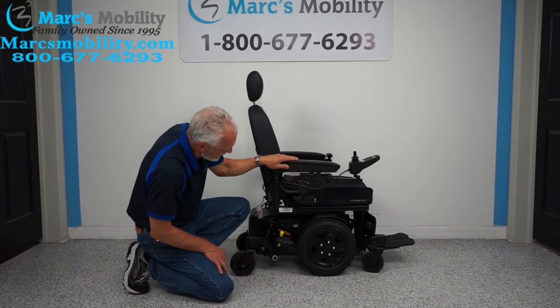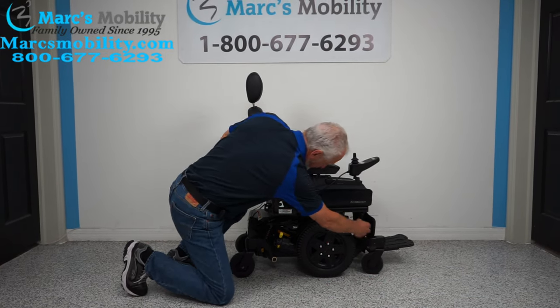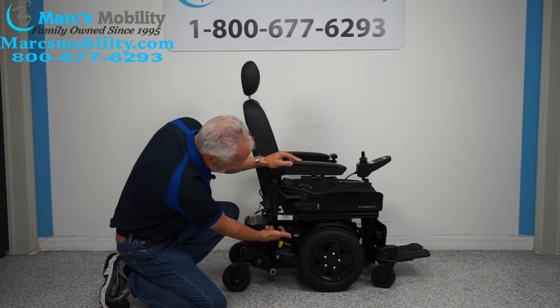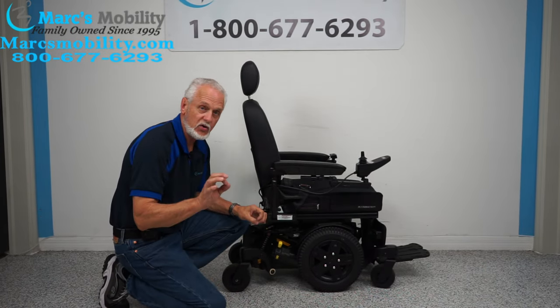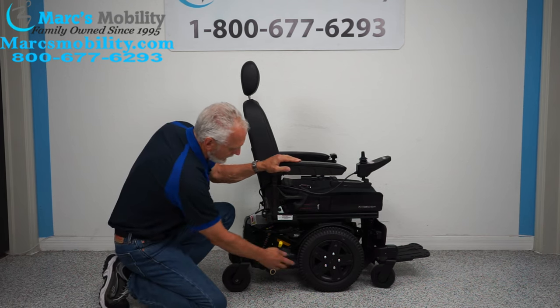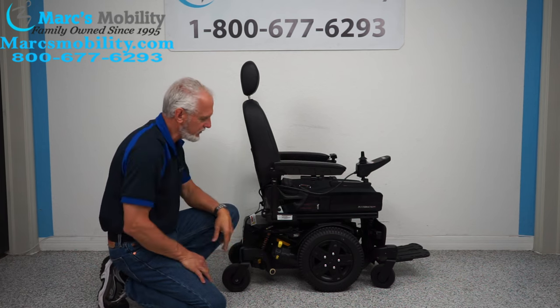You have also on this chair an anchor point right here, and you have another one right here. So you have four anchor points to secure your chair to your lift or to your van. You also have a motor for each wheel — each wheel has its own independent motor.